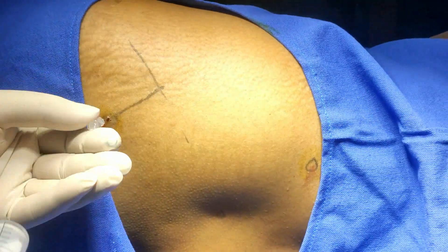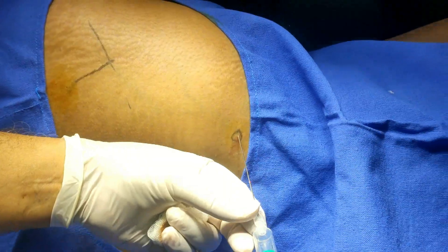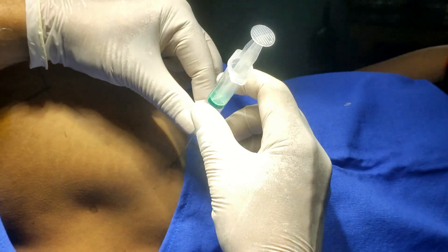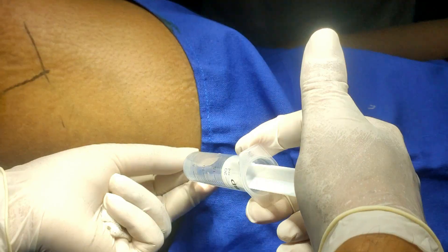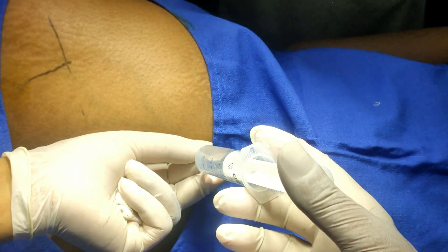The registration is coming and this block is complete. From here I will inject and keep the direction at 15 degrees. Check for the loss of resistance — aspirate and then inject, aspirate and then inject.